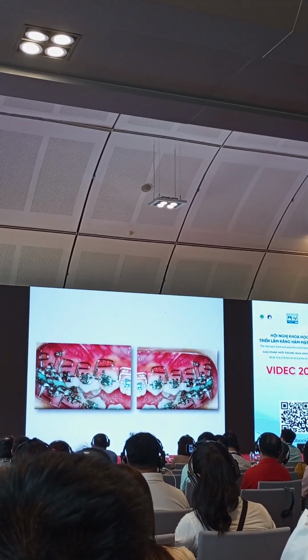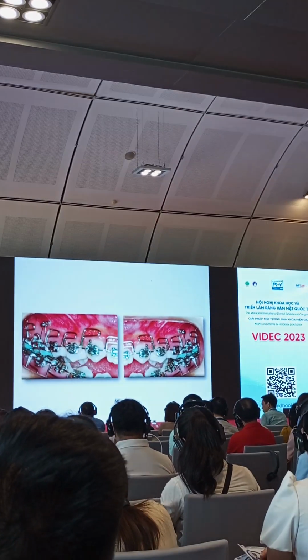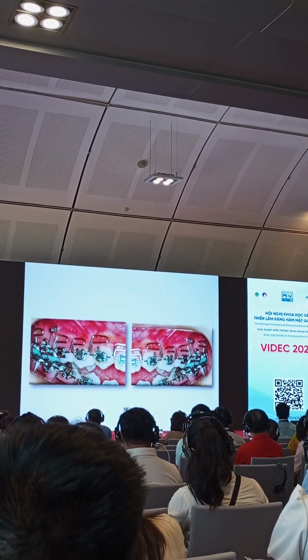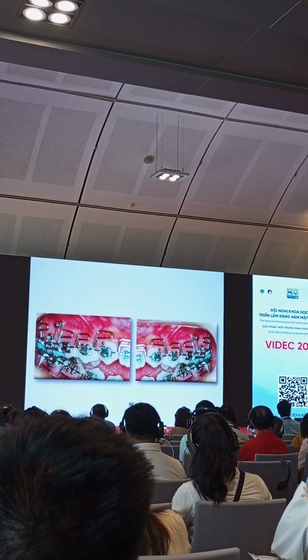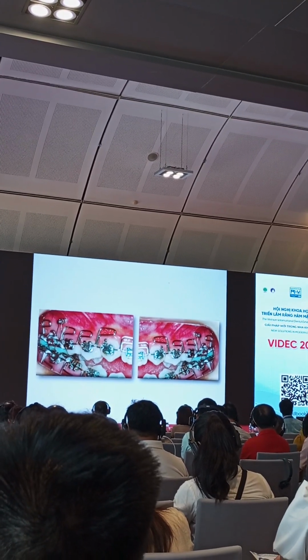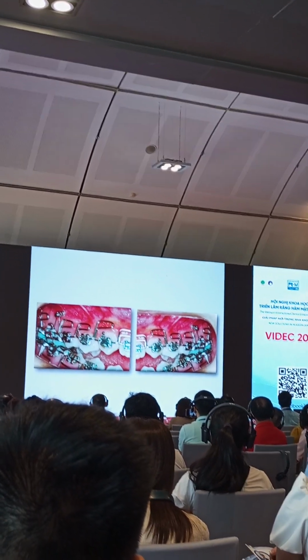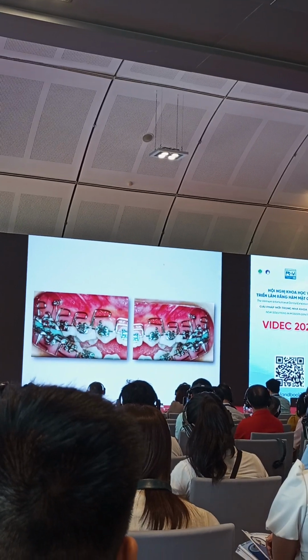It will make my molar tip buccally into a crossbite. That is my mistake. But I cannot do anything because of my fear to insert mini implant on the palatal region. So I continue intruding it, either with a ligature wire or with elastics.